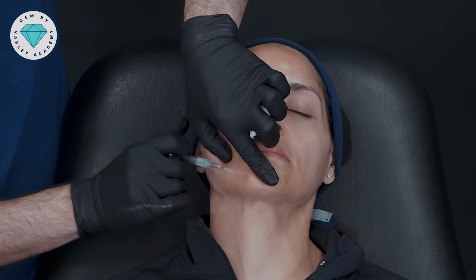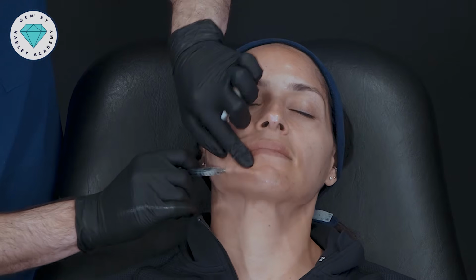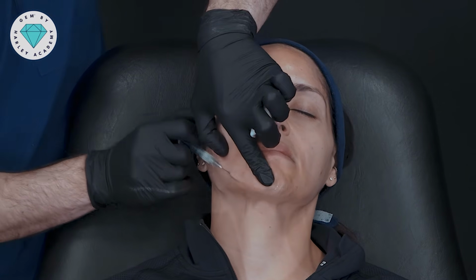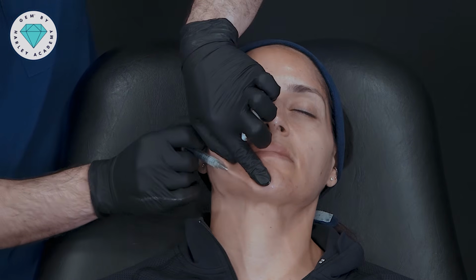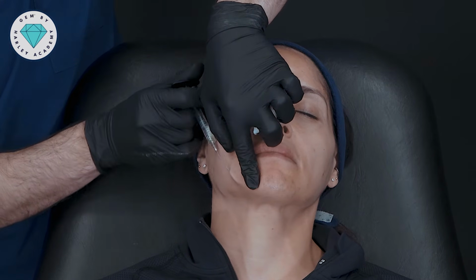This is something called dermal detachment, where we're just detaching the muscles from the overlying dermis, and in the process creating much more of a smooth transition throughout the chin, the lower jawline.